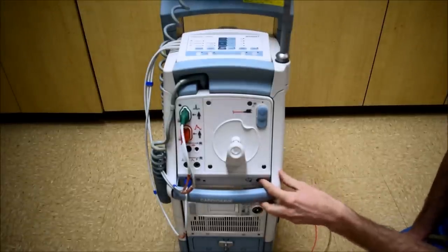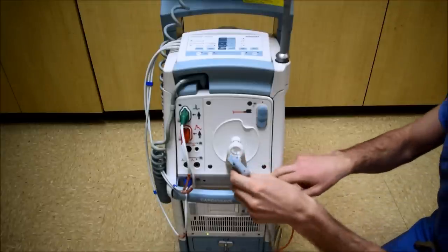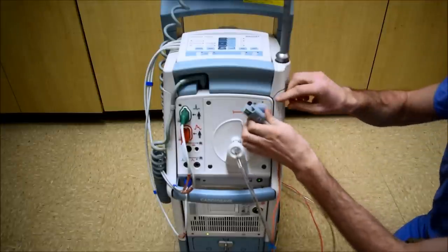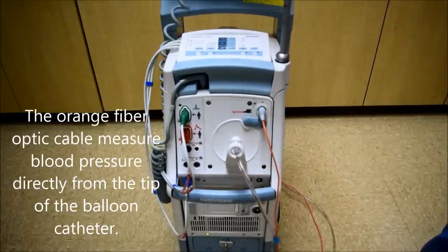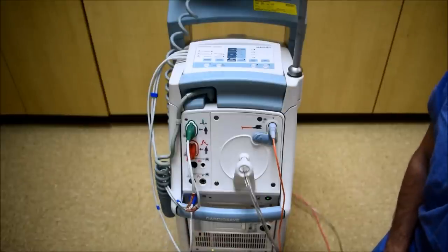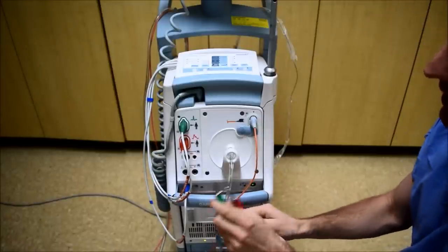To power on the balloon pump, press this button here. When you receive the lines from the sterile field, they're inserted here. This line is where helium is shuttled back and forth, and this is the fiber optic cable. The EKG line and pressure monitoring lines are connected here. This blue line is only for the purpose of this video as it goes to the simulator. If you're slaving from the patient's monitor, those lines are hooked up down here.